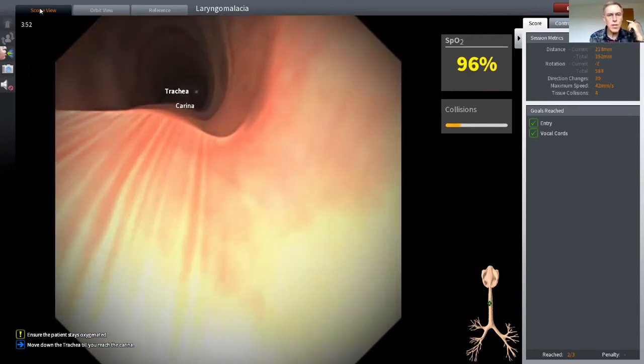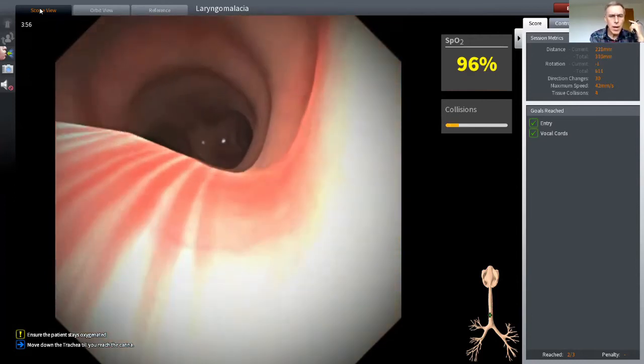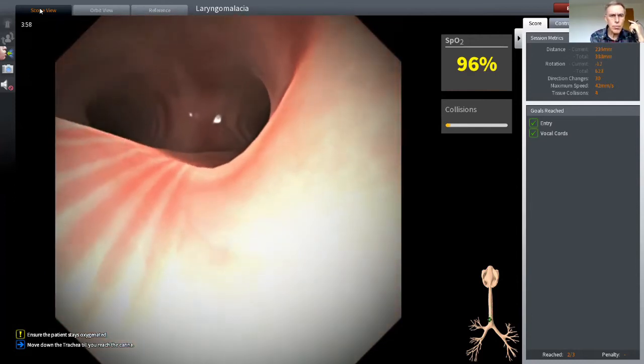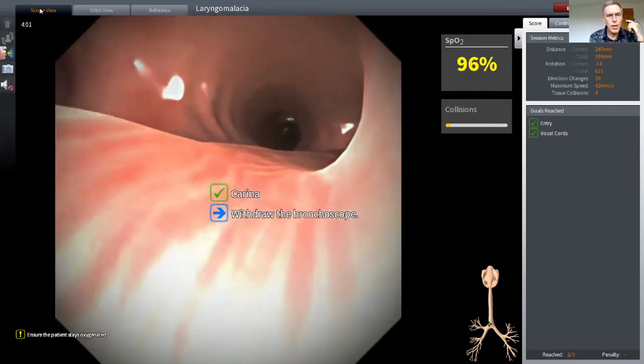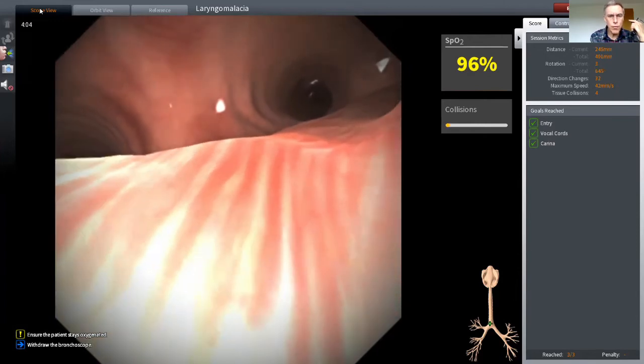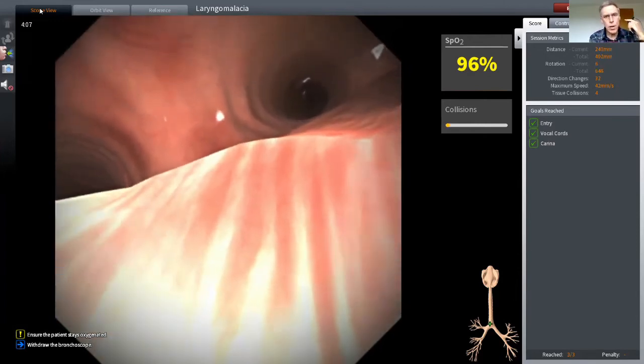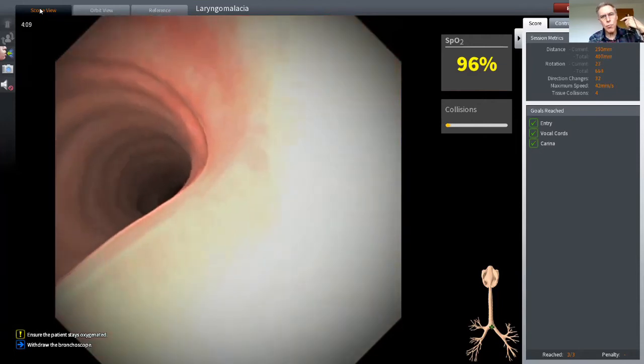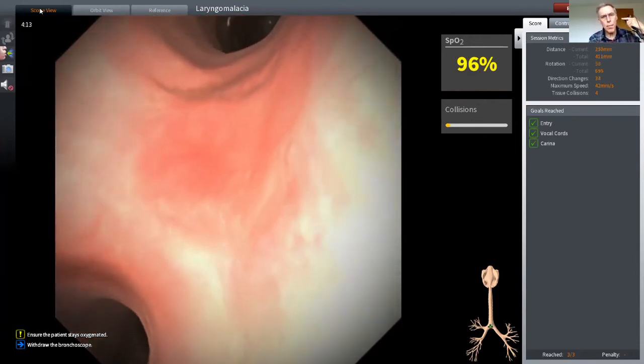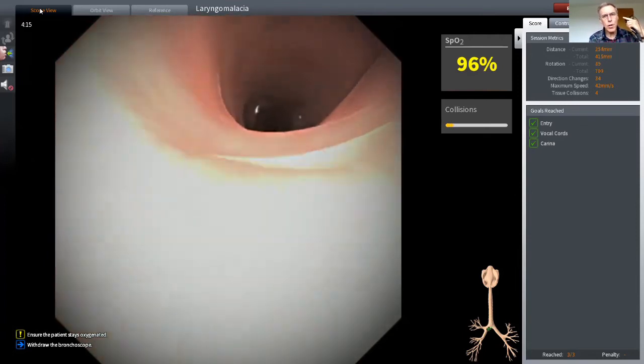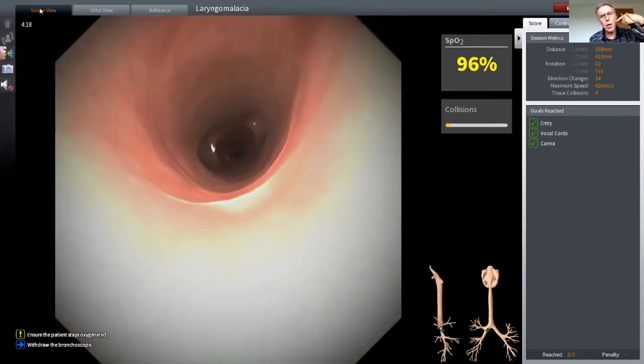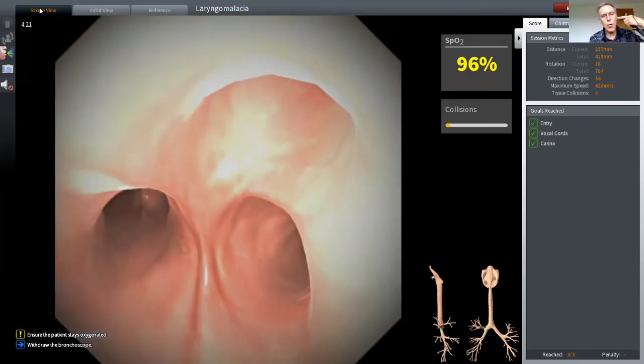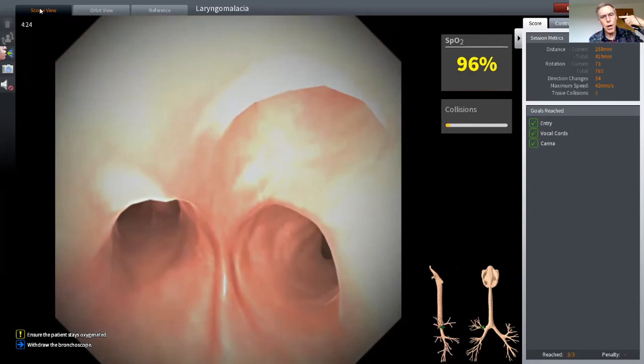So I'm moving down the trachea towards the distal end, and coming into view is the carina. That's where the airway divides into two parts, one feeding each lung. So I'm going to turn my tip and move into the right upper lobe by bringing my tip up, and if I turn to about two o'clock, I will be able to move up into the right upper lobe, and there we see the three segments of the right upper lobe.